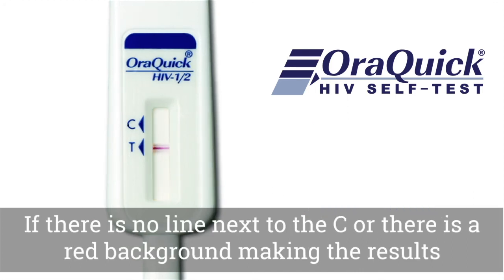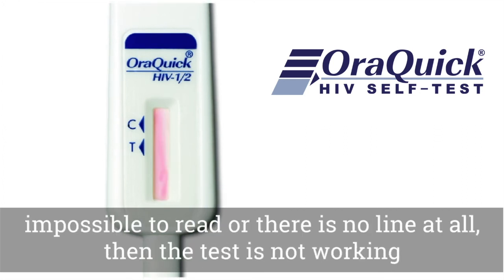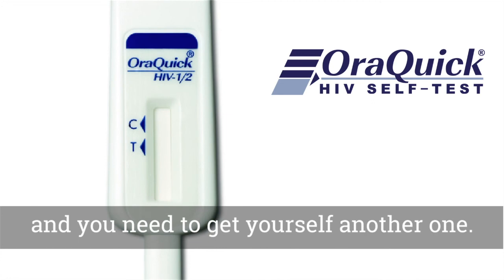If there is no line next to the C, or there is a red background making the results impossible to read, or there is no line at all, then the test is not working and you need to get yourself another one.